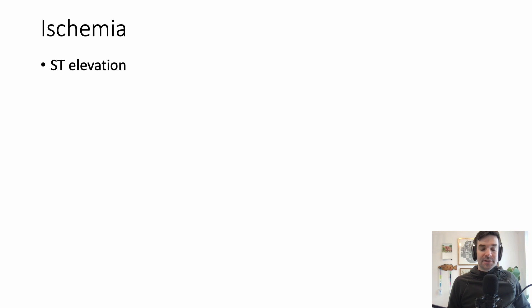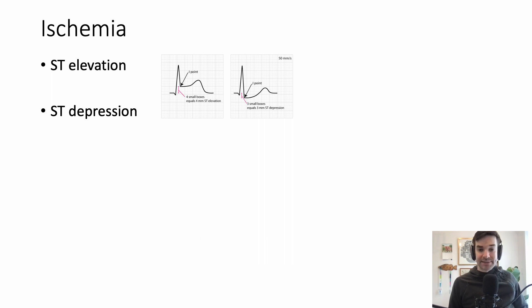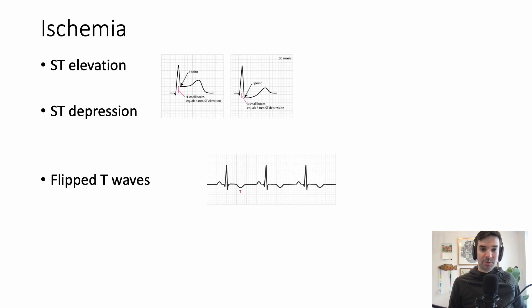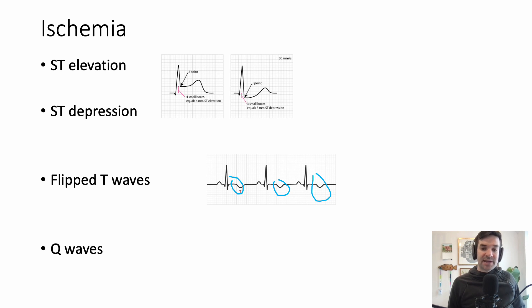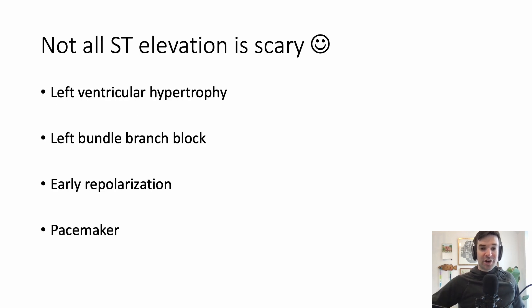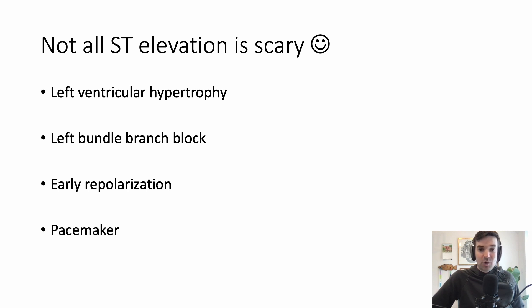Next, we're looking for signs of ischemia. Is there ST elevation or ST depression? Both are signs of ischemia. You can pause the screen and zoom in to see exactly how to tell if there's ST elevation or depression. Flipped T waves — in general, inverted T waves are abnormal. You can see a flipped T wave here; it's upside down. You can see this normally in V1, but in other leads it's typically abnormal. And then Q waves — this is a sign there's probably been an old infarct; you can see this very deep Q wave here. Not all ST elevation is scary: it commonly comes from left ventricular hypertrophy, a left bundle branch block, early repolarization, or if the patient has a pacemaker.